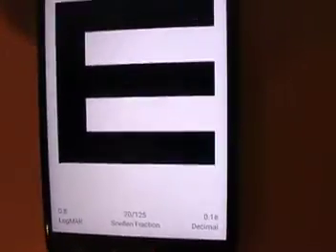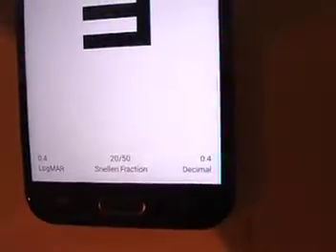This is visual acuity that should be measured at 20 feet or six meters. You should read half the letters correctly. Sweeping up changes letter. In this case we have 20/50.